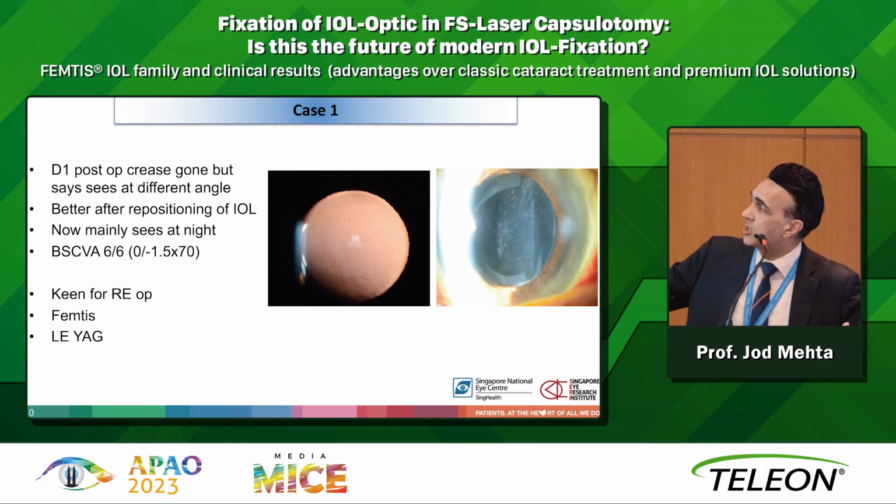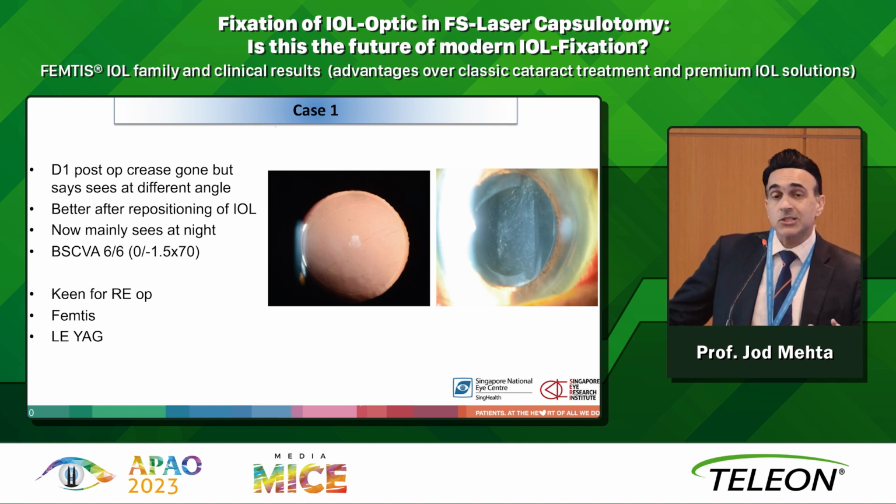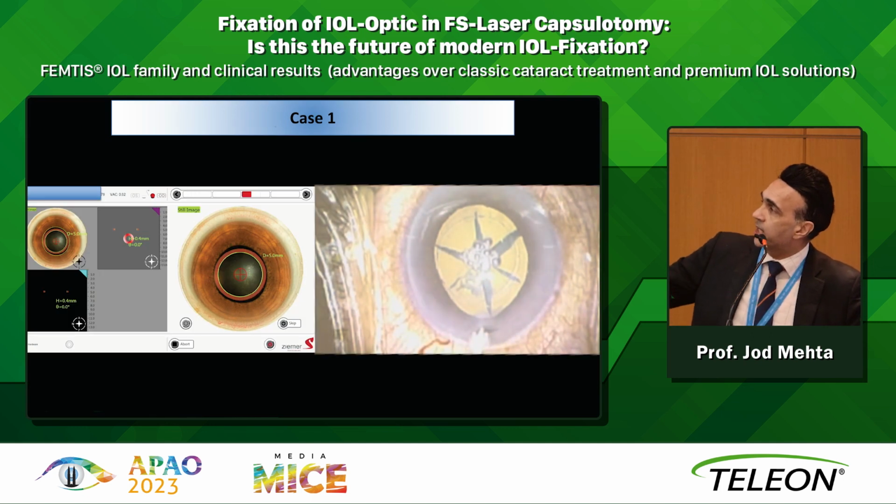So she said, I'll tell you what, let's go for the other eye surgery. What are you going to do for that side? So I said to her, well, okay, let's avoid this situation completely, and let's clip your lens to the anterior capsule. Then I don't care what size your bag is because it's not going to make a difference with my surgery. So typically I'll use the Z8 for the cataract surgery.